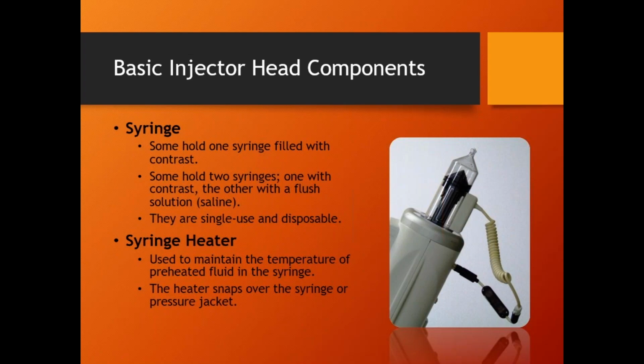And another thing too, there's just a couple exceptions to this rule, but for the most part, the syringes are model specific. These syringes go on the Stellant and only the Stellant. They don't fit on any other model. And that is true on almost every other model. The only exceptions I can think of is the Mark V Plus and the Provis, but the Provis was the replacement for the Mark V Plus, so they didn't change syringes when they upgraded their machines. And then Liebel Florsheim makes two different models of injectors, but they use the same exact syringe. But other than that, every other model out there has a syringe unique to just it.